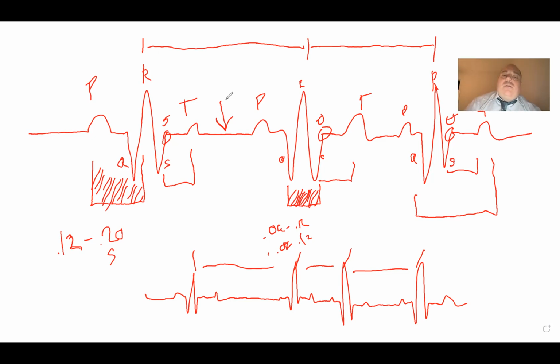So just something else to throw out there for you guys for the QT interval. This is important to pay attention to. And if it's normal, fantastic, go about your life. But if it's prolonged, we have to ask, is this naturally prolonged? Because there are people that have naturally prolonged QT intervals. It's just the way their heart is wired. But there are medications commonly prescribed by prescribers and practitioners that you're going to be using that have an effect of prolonging a QT interval.